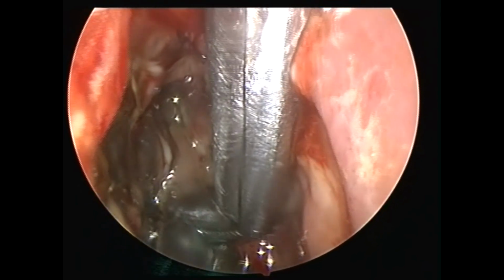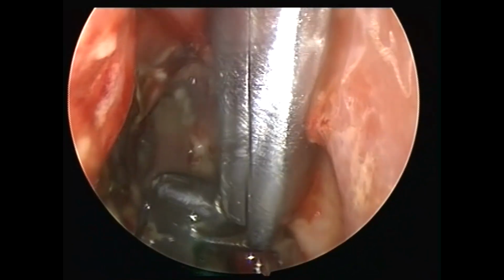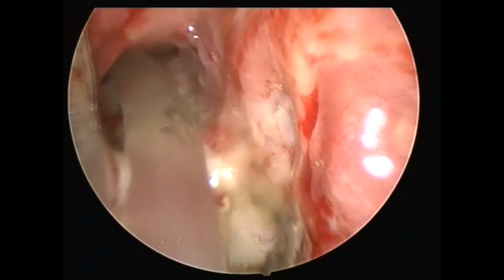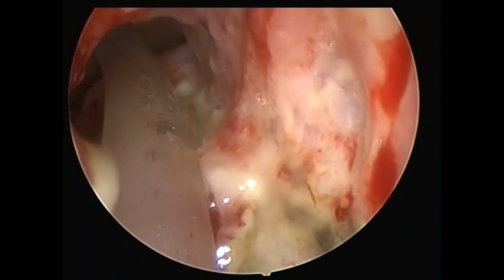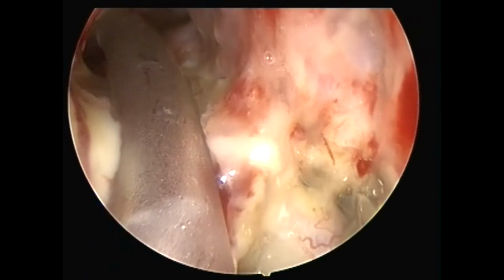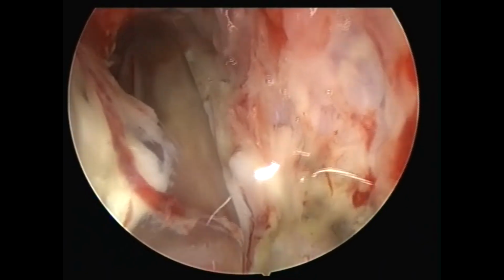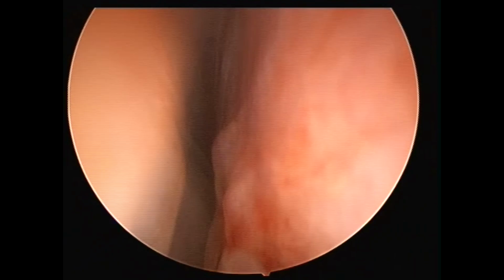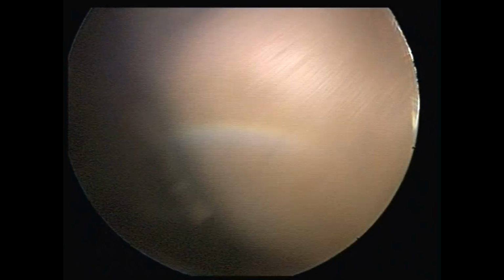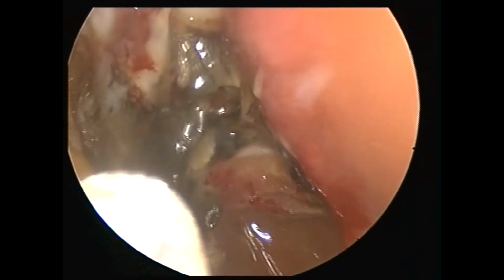So you can see it's all clear fluid that is coming out, so there is no sign of any fungal debris inside. So I'm going to take the tube outside now and I'm going to check inside. You can see the roof of the sinus very clearly, and now I'm going to give a wash under vision. You can see all that fluid coming up and then going down. So the sinus is completely clear, and I also achieved a very huge frontal glow, the Friedman sign, the photo of which I'm going to show you at the very end. So the maxillary sinus and frontal sinus, both the sinuses which were mainly involved by the fungus, are completely free of fungus right now, 15 days post-op.